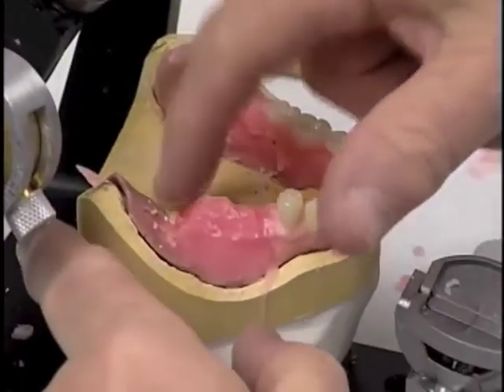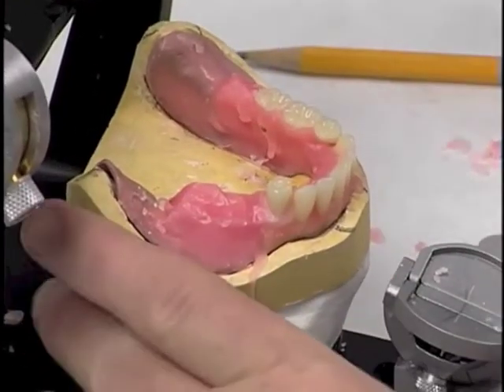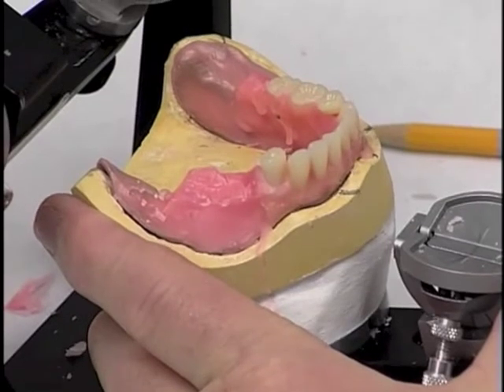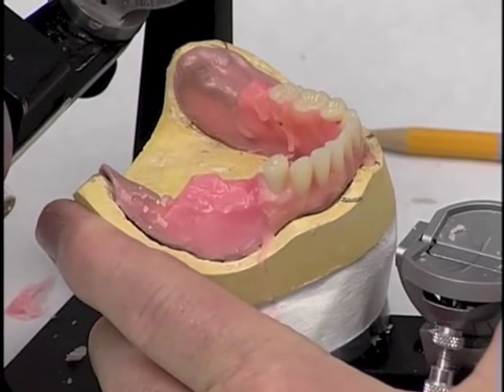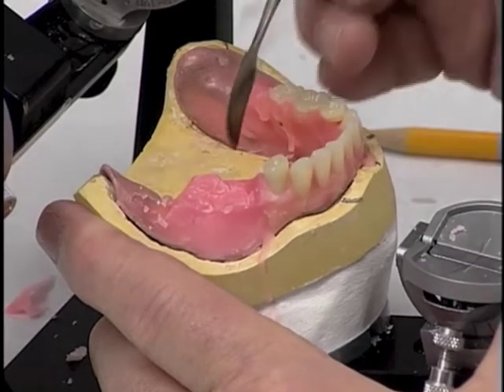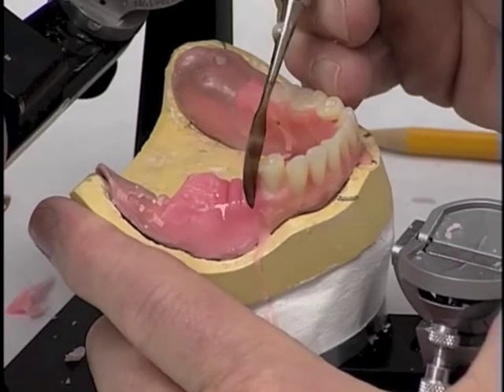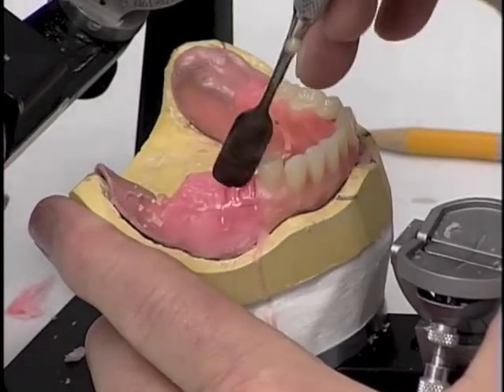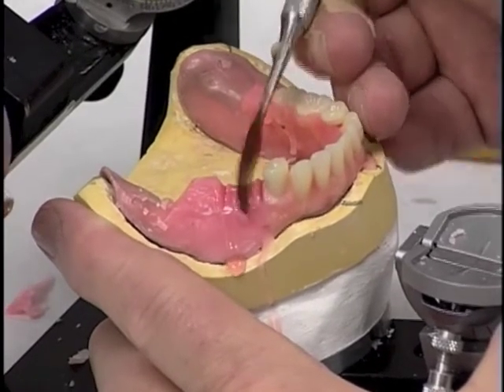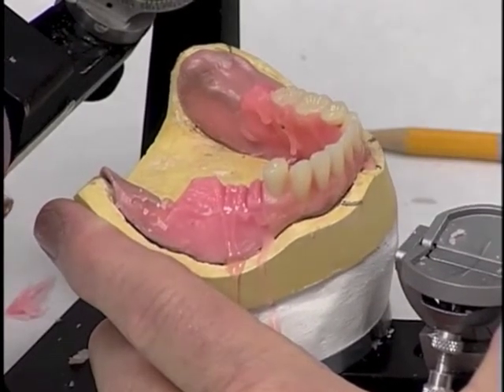Once we have the wax removed from there, again, we're going to soften the wax in the area of the first molar now. And we think we have it softened enough that it will hold the tooth, and we can move the tooth around to where we want it to be.